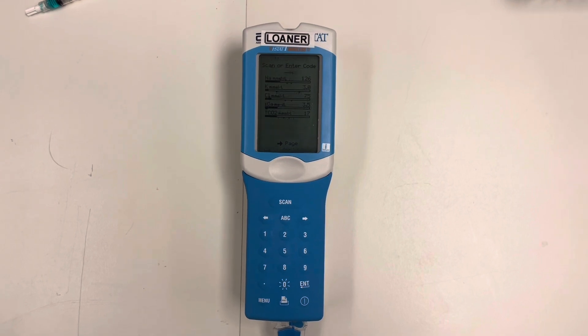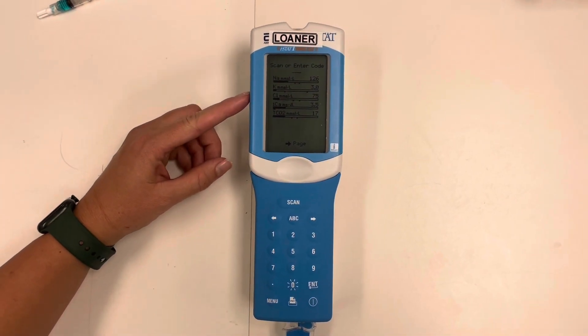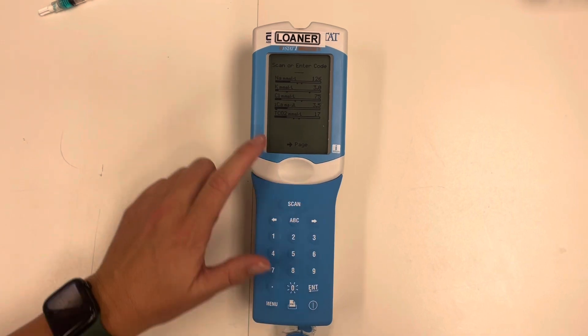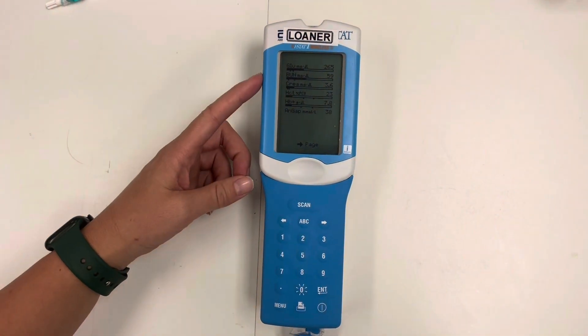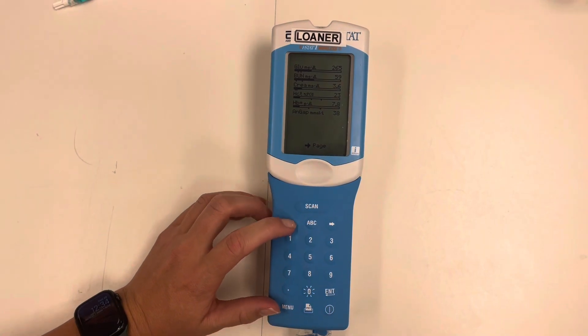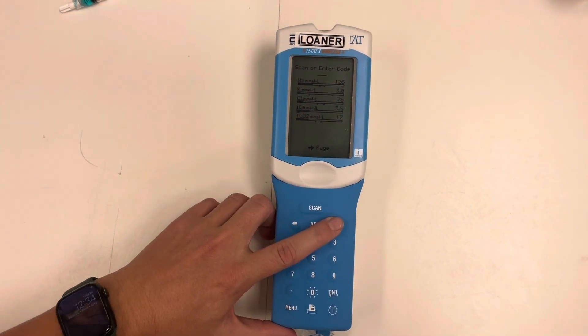Here it has beeped — we know it's done. We can see our results: sodium 126, potassium 3.0, and so on. We want to hit the page over button so we can see all the results. Glucose 265. We can toggle back and forth between the two.